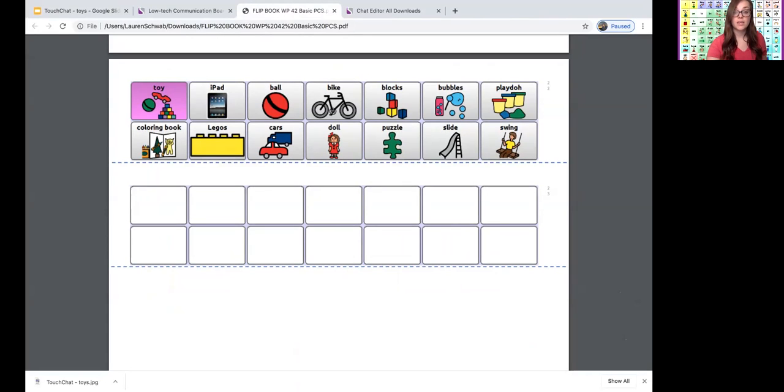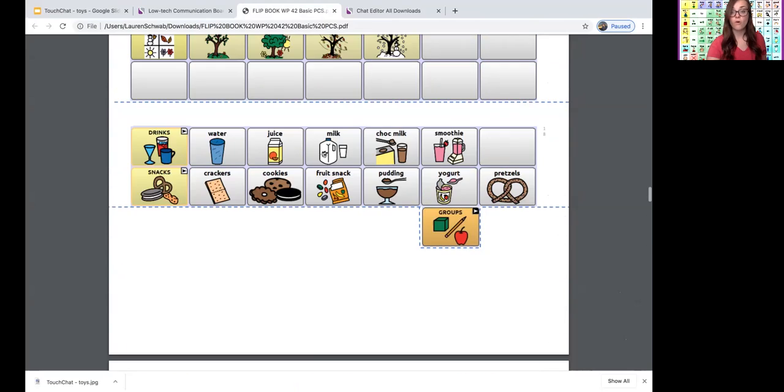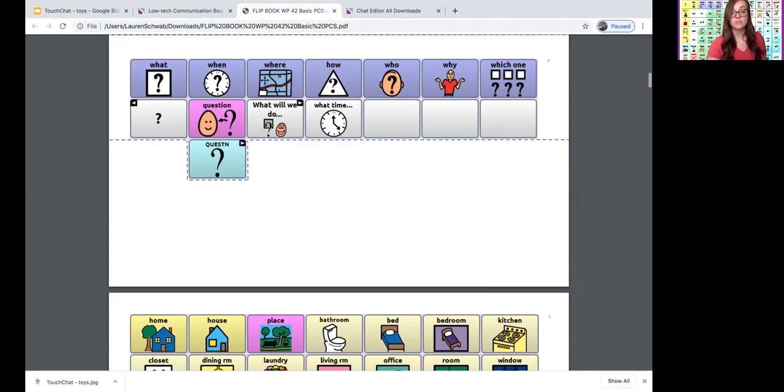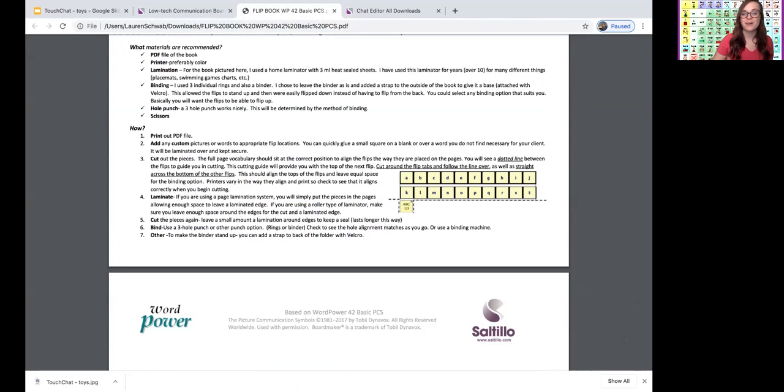Then you can change the color as well using format, and you can circle when you're modeling. All you need to do is press undo to get rid of it, or you can press clear my drawings, and then make sure you select mouse again in your annotation bar to scroll. So that's a very easy, low-tech way to share and to model without really any of the prep behind you.